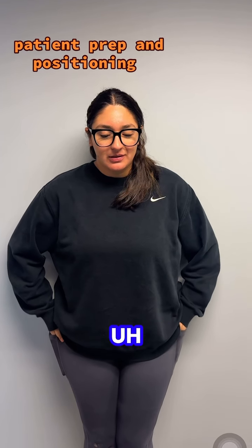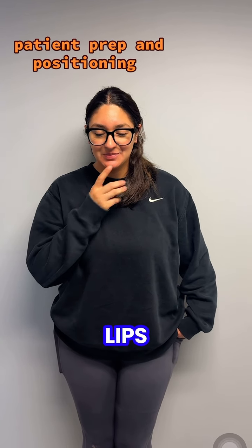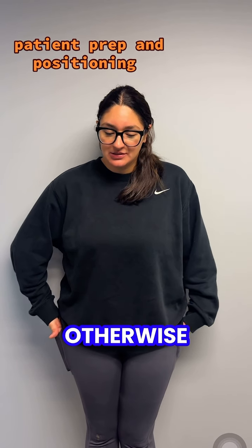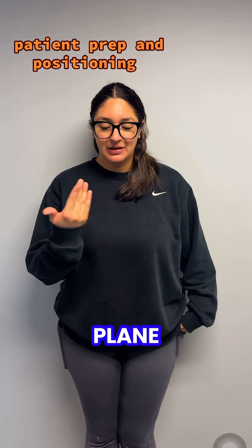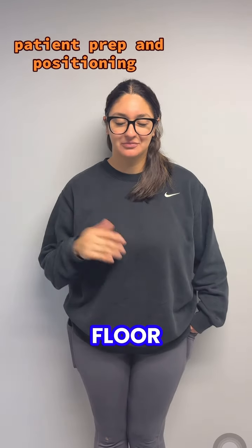For patient positioning, you want them to bite on the bite block, lips closed, tongue on palate. Stand tall, otherwise you have an error. You want the mid-sagittal plane perpendicular to the floor and the Frankfort plane parallel to the floor.